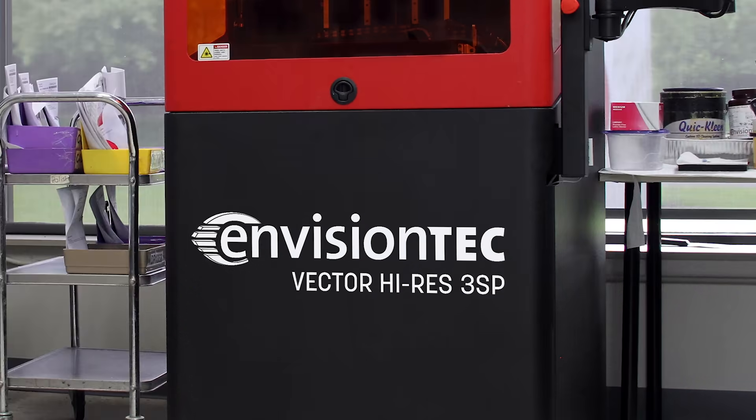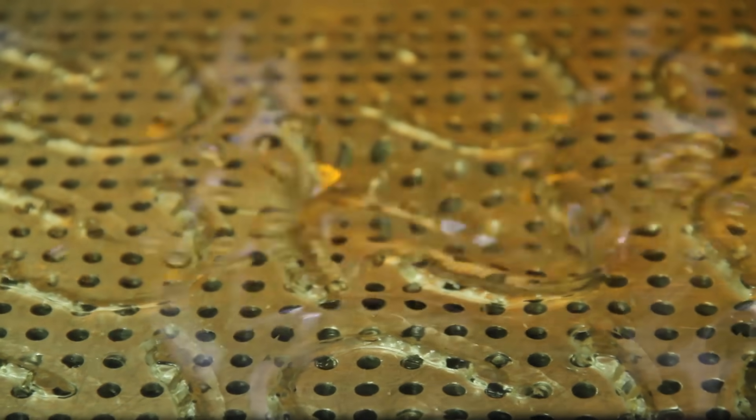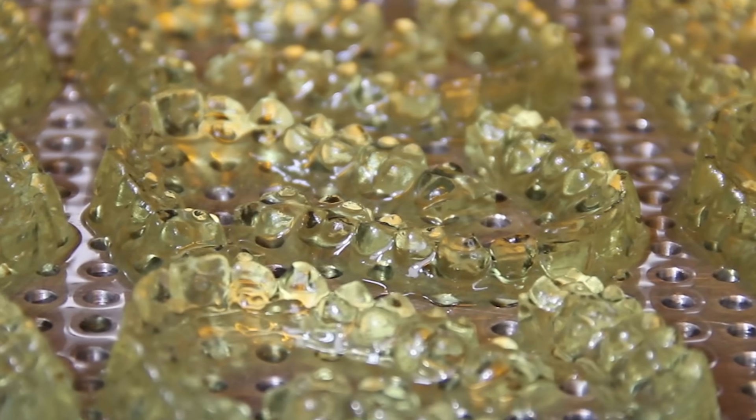We also have the Vector3SP high-res, which has an XYZ resolution of 50 microns. You could print about 15 to 20 high-resolution crown and bridge models on this machine in underneath 4.5 hours.